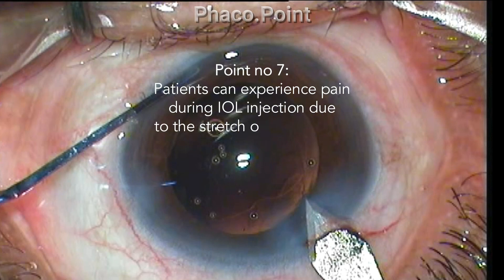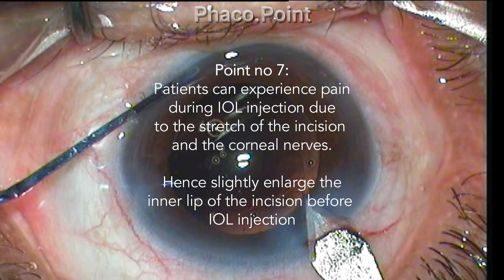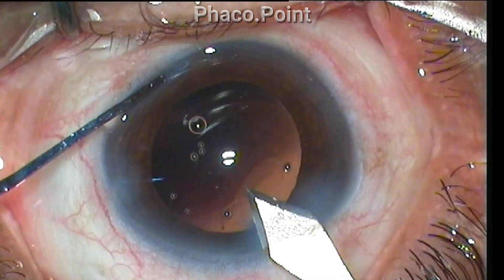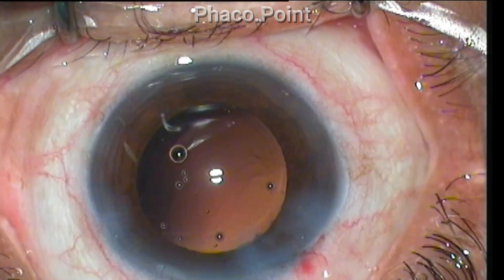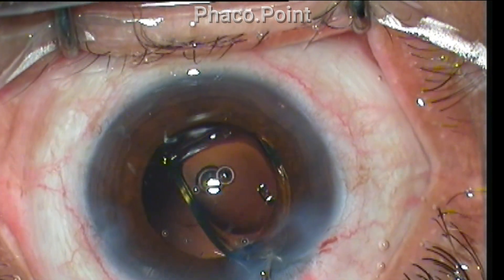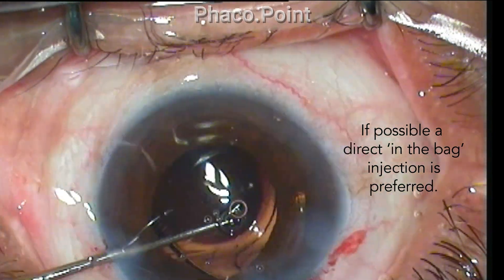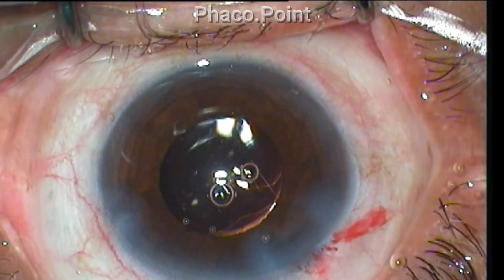Point number seven: patients can experience pain during IOL injection due to stretch of the incision and corneal nerves. Therefore, slightly enlarge the inner lip of the incision before injecting the IOL — this makes the patient much more comfortable under topical anesthesia. In this case I am slightly enlarging the inner corneal lip, and you can see the intraocular lens injection proceeds smoothly. Complete in-the-bag delivery of the IOL is ideally suited for topical cases, so as not to touch the iris surface unnecessarily.